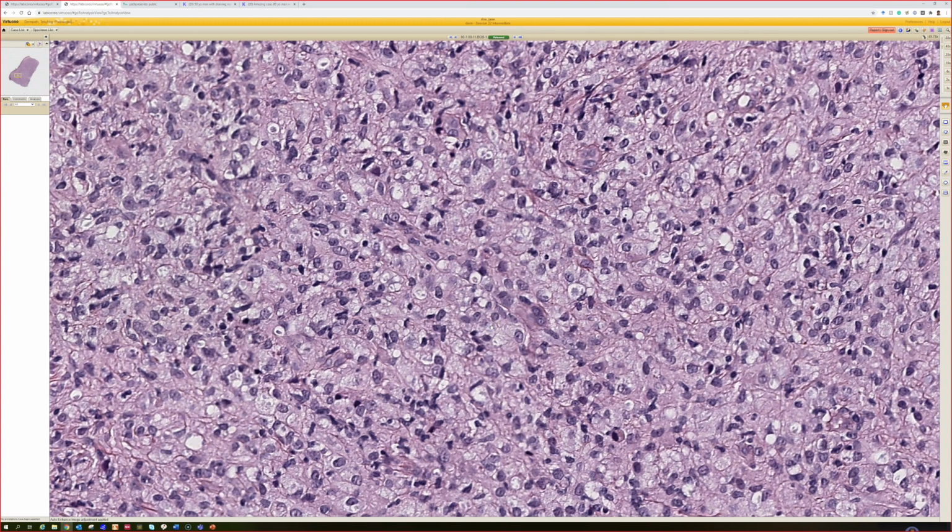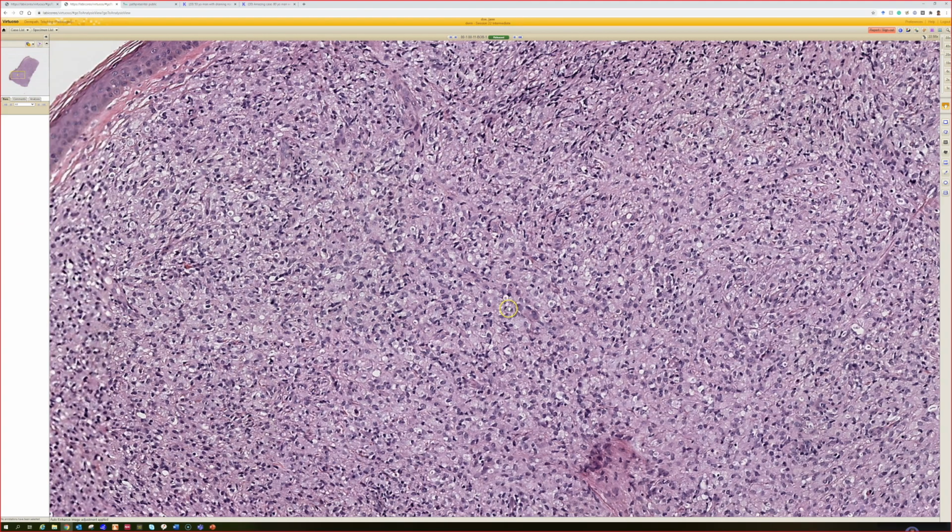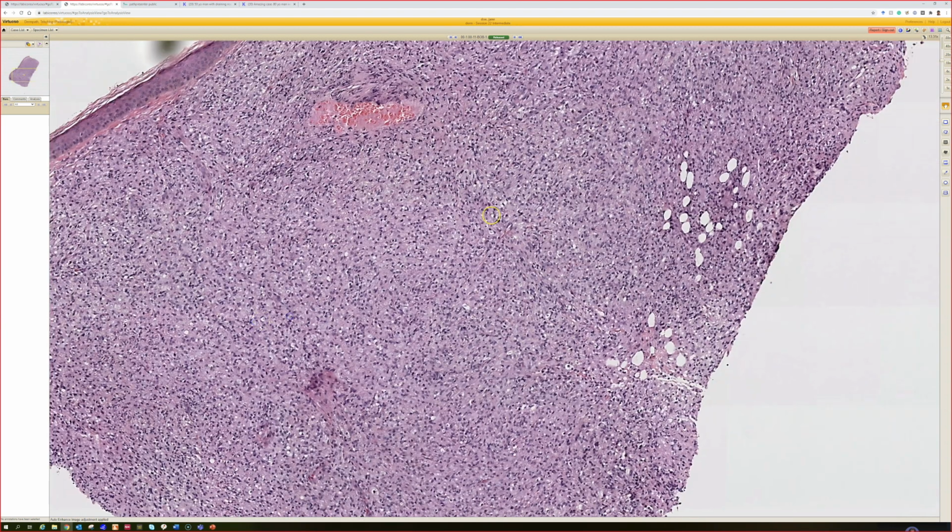Very good. This is sheets of histiocytes with a pale, frothy, loose-looking cytoplasm, and then they have those little empty holes or spaces like vacuoles filled with, all of those are going to be Mycobacterium leprae organisms. So this pattern is very distinct for leprosy, particularly the lepromatous form. You could even argue that this one might classify as histoid leprosy, which is when it basically becomes a fibrohistiocytic pseudotumoral response to leprosy.